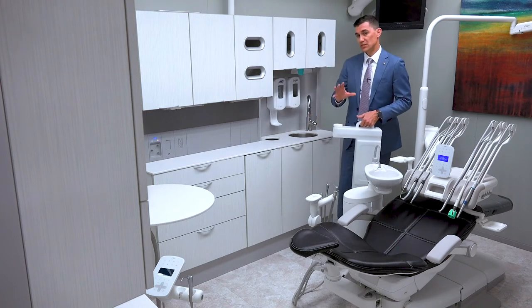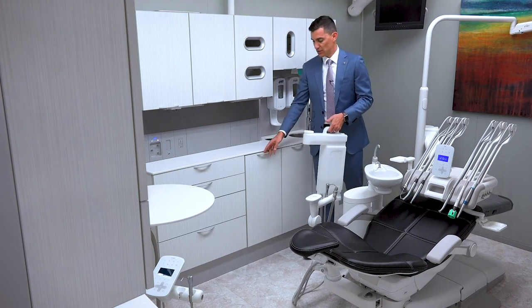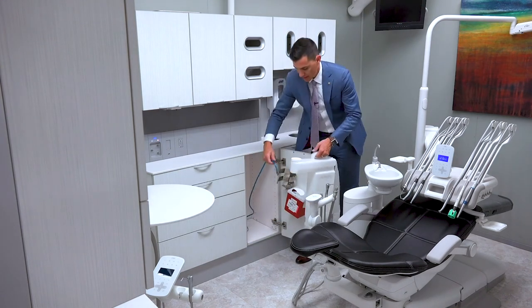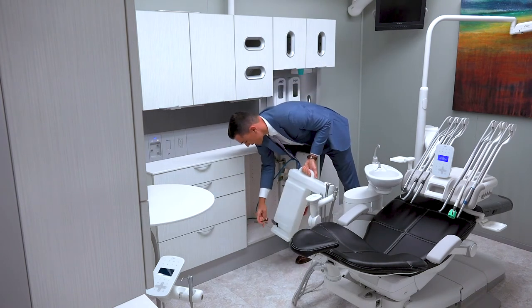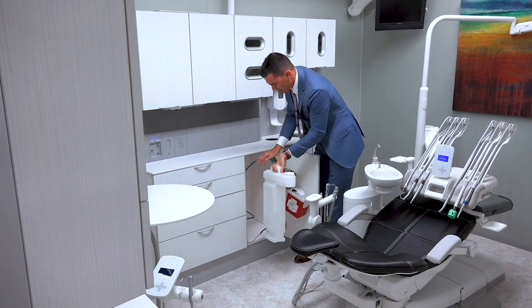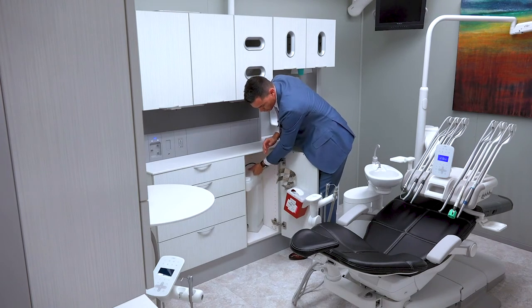If you don't have a central cabinet, you can actually store this in a side cabinet. We have our pickup right here for the tank itself, and the power for the tank right here — we're going to plug both of these back in. We're then going to place this back into our side cabinet and close the door.